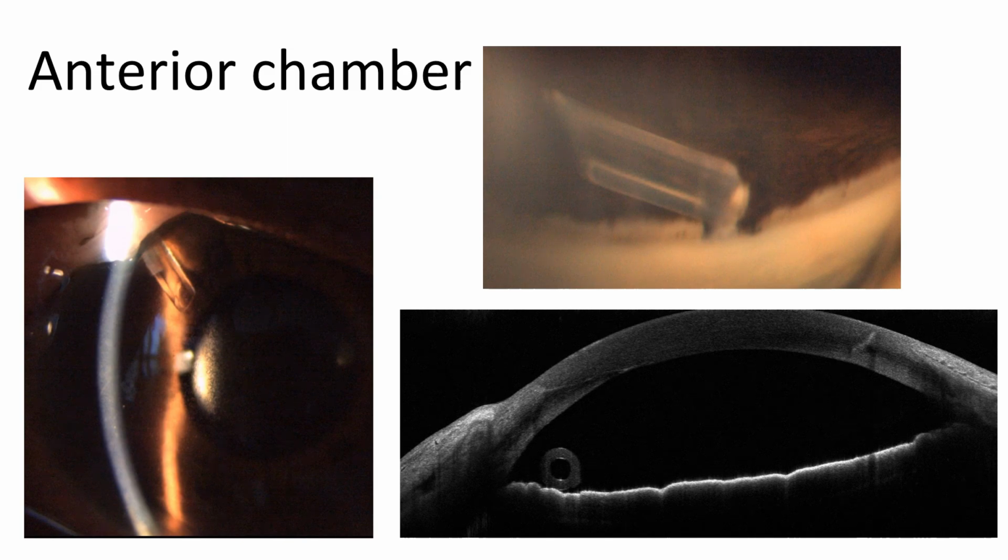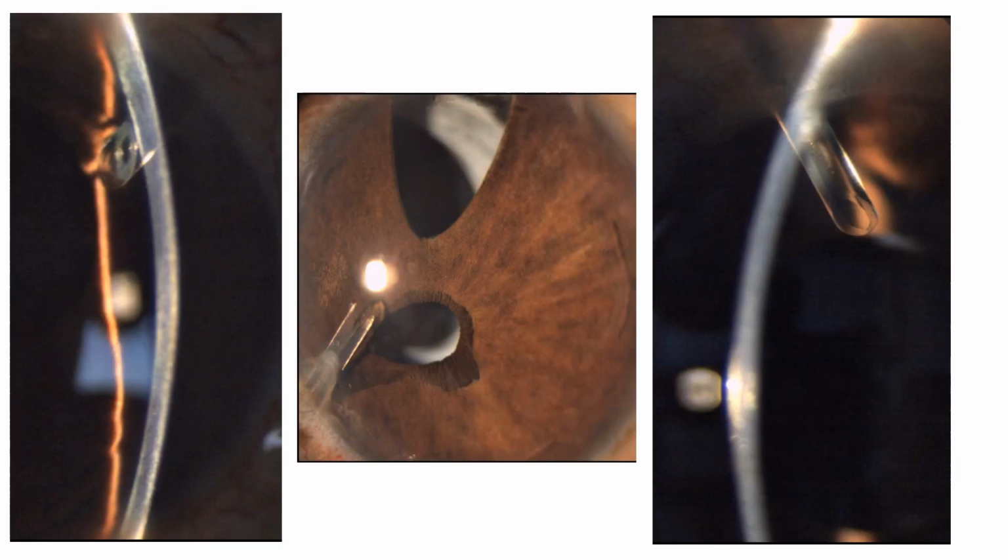These are some of the suboptimal entry points for the anterior chamber tubes. Note the focal tube-corneal touch in these images. Gonioscopy of the tubes will also help us to find the exact entry points of the tube. Note the quite anterior location of these tubes.